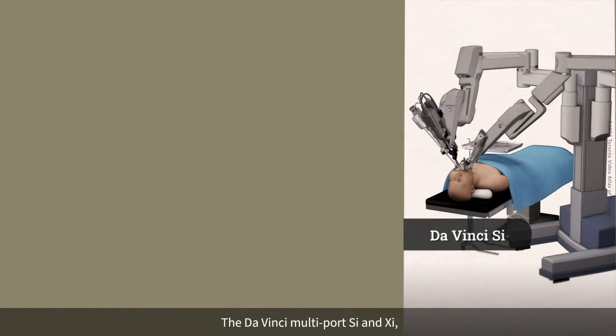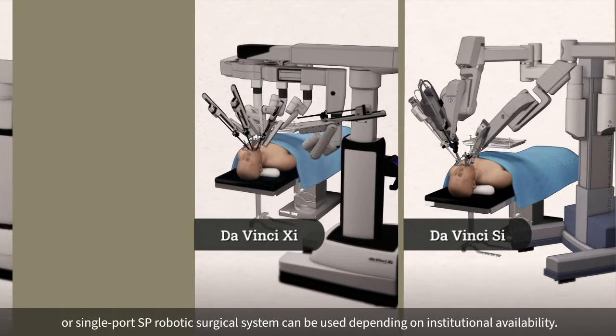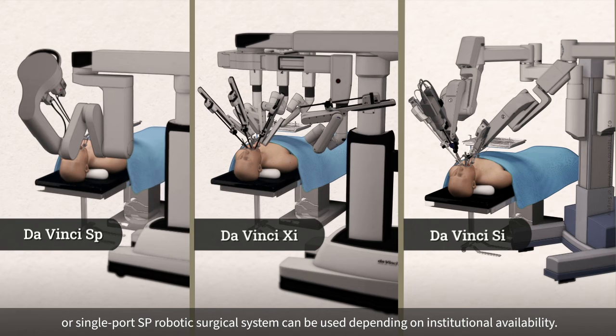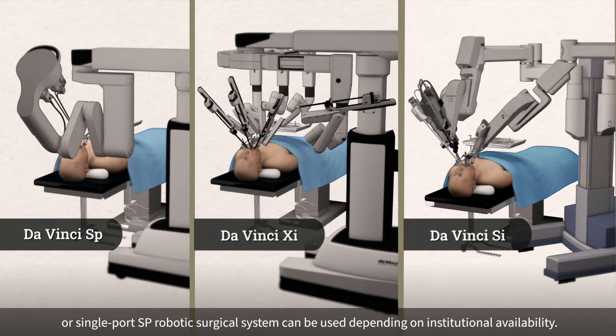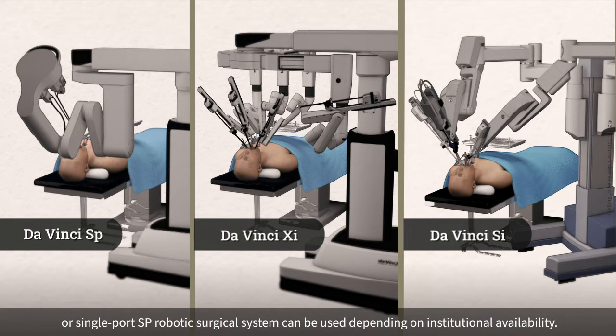The da Vinci multiport SI and XI or single port SP robotic surgical system can be used, depending on institutional availability.